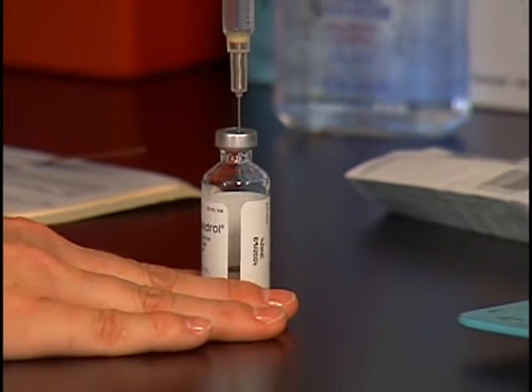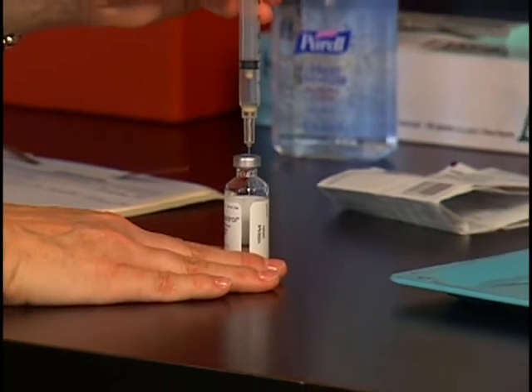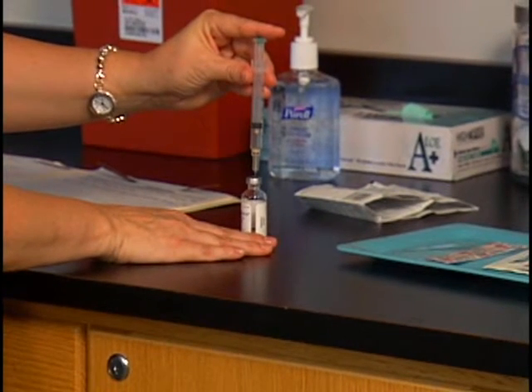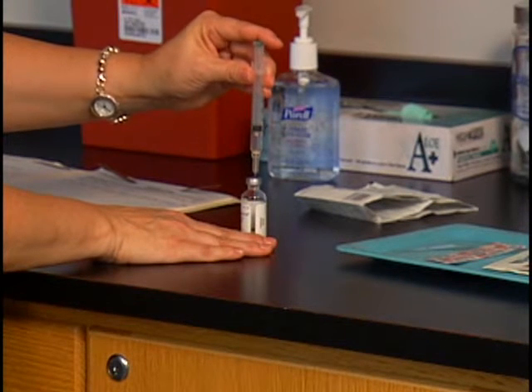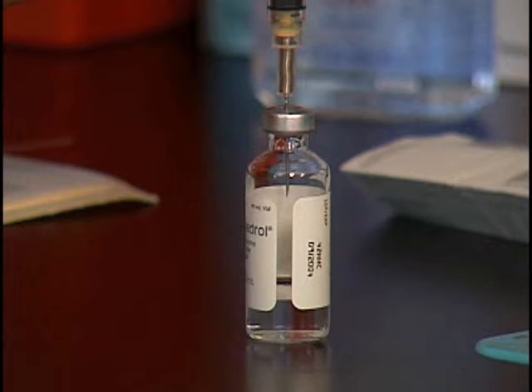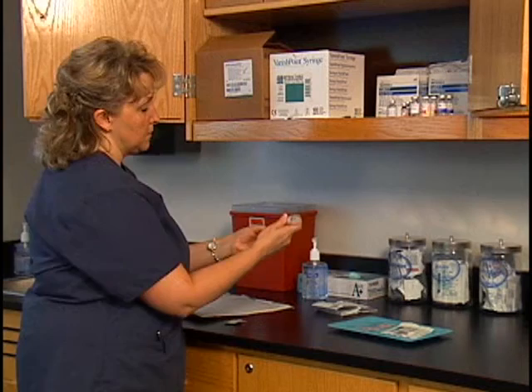Using moderate pressure, insert the needle through the center of the rubber stopper at a 90-degree angle until it reaches the empty space between the stopper and fluid level. Be careful not to bend the needle. Push down on the plunger to inject air into the vial. Injecting air into the vial prevents the formation of a vacuum, which would make it difficult to withdraw medication. Make sure to keep the needle opening above the fluid level to avoid creating air bubbles in the medication.